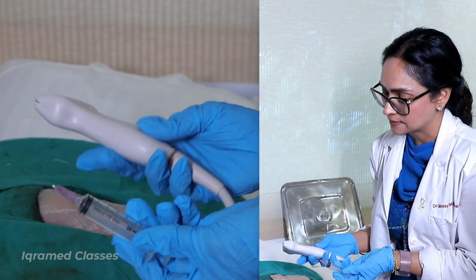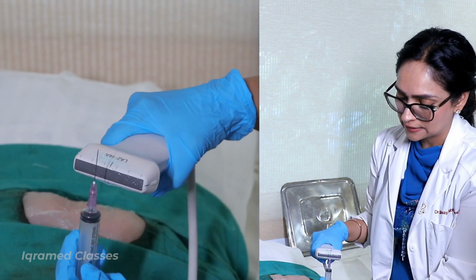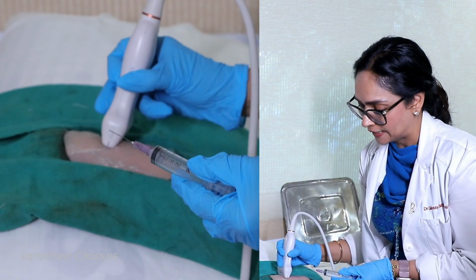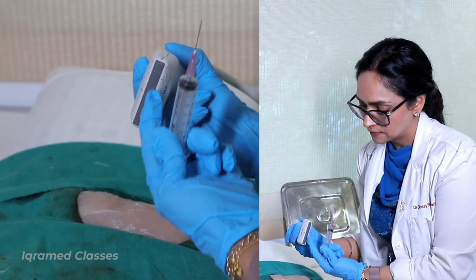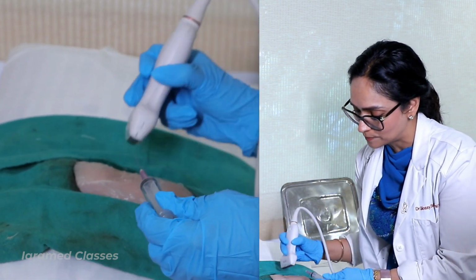That means that this and this needs to be parallel. If I put it like this, this is end on. If it comes like this, it is parallel. So my direction of the probe and this needs to be parallel to each other. So if this is the probe, it has to be parallel. How am I going to keep both of these parallel?